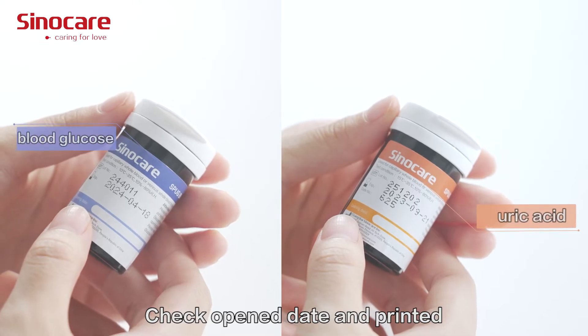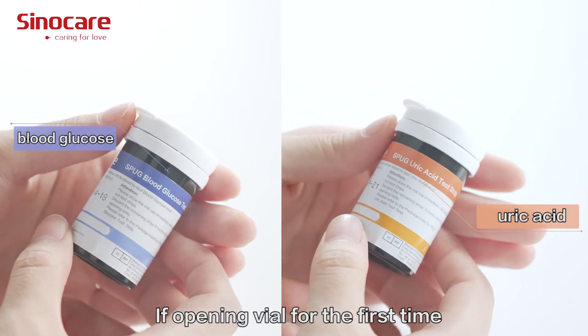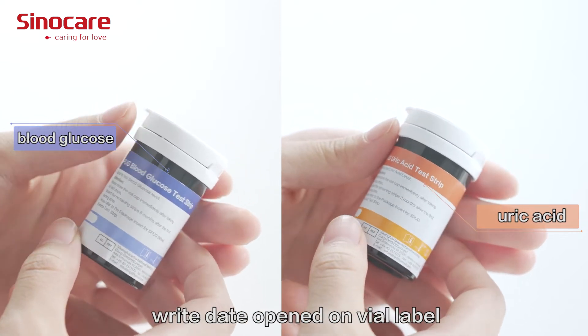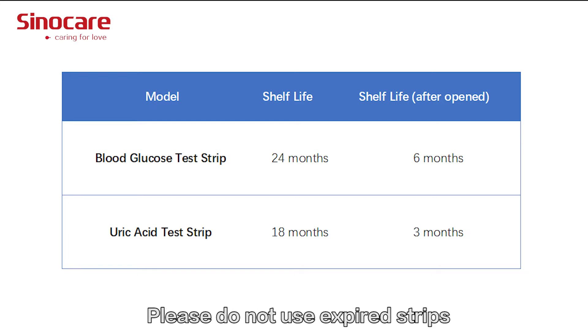Check and confirm the open date and expiry date on the test strip vial label. If opening the vial for the first time, write the open date on the label. The shelf life details are shown on the screen. Please do not use expired test strips.